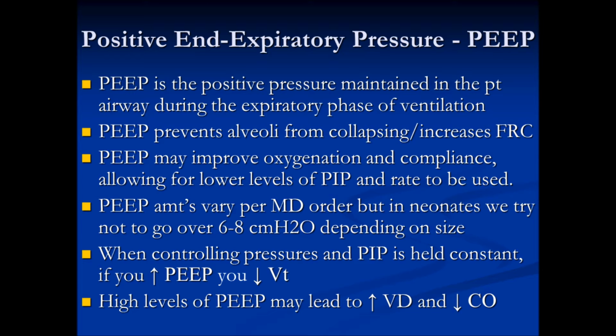Okay, PEEP amounts vary per MD order. So when you are working in a hospital, they will have their protocols in place, and you should be following the hospital's protocol. Don't go to the hospital talking about, well, the MBRC says we can put a PEEP all the way up to 8. Well, that may not be that hospital's protocol, but you need to remember the tests way. You got to have on your test hat when you're in the test environment and have on your clinical hat when you're in the clinical environment.